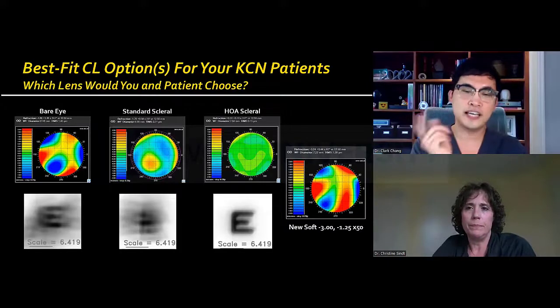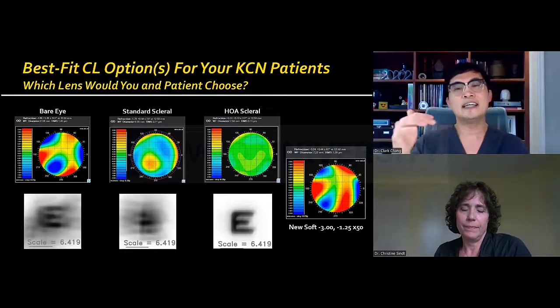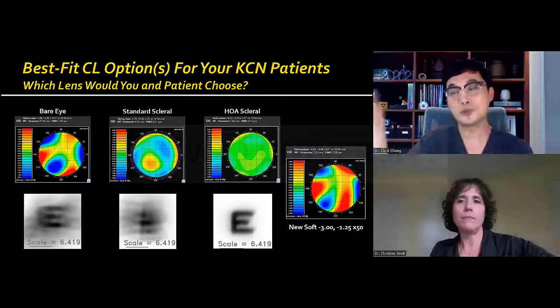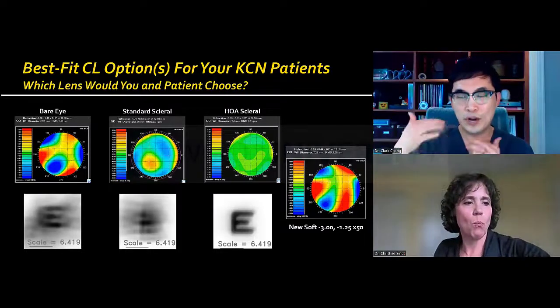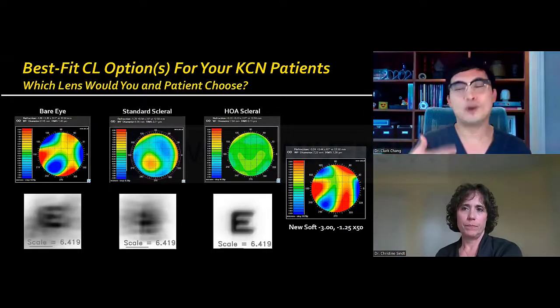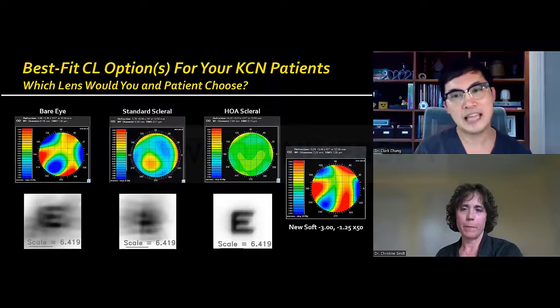Right. And just to close the case that you were alluding to, I had a patient who came to me after cross-linking and Intacs to stabilize keratoconus, to see if she could improve. She was rather GP intolerant: she's willing to wear it as much as she can, but she always feels like something's in the eye, even though she's able to tolerate it for most of the day. So they thought, well, why not do this, many years ago.